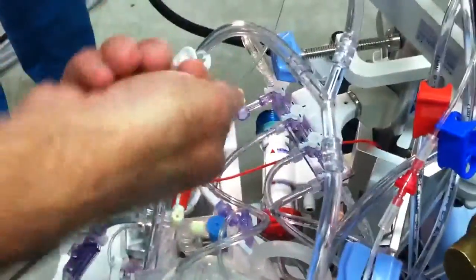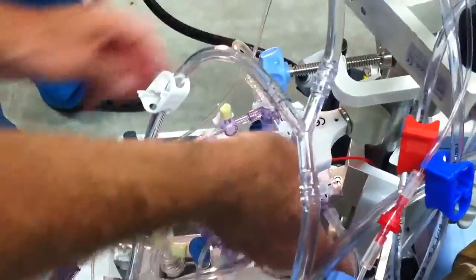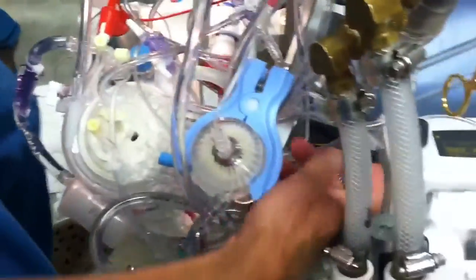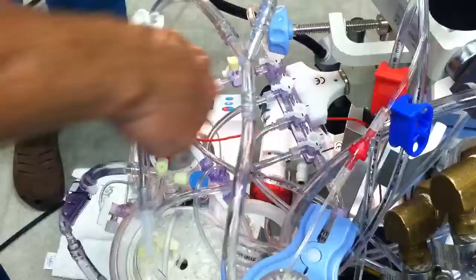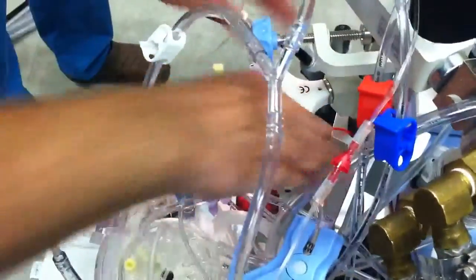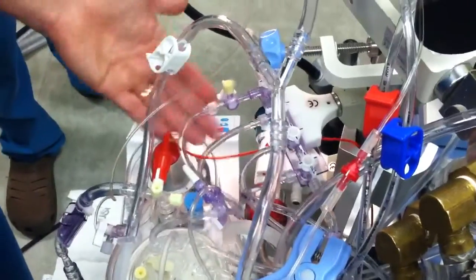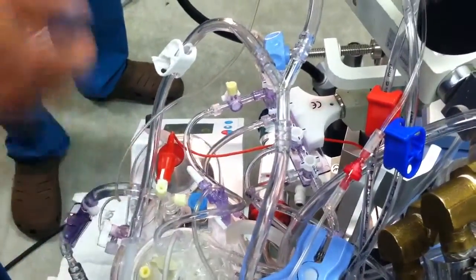We're going to turn the first and the last stopcocks out — tails out — at the same time. When I do that, the fluid will come from this line into the stopcocks, across, back into the reservoir. So we turn sideways — it's done. It already did, just that fast. All the fluid flies through because it's under 100 millimeters of pressure, it flies through.